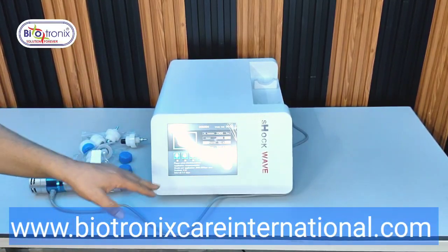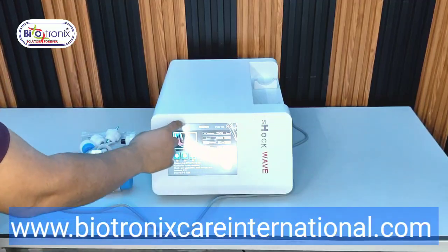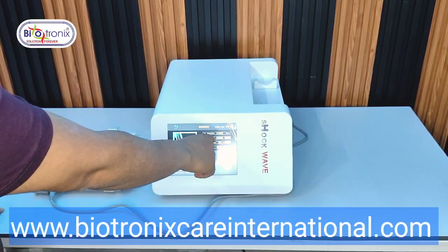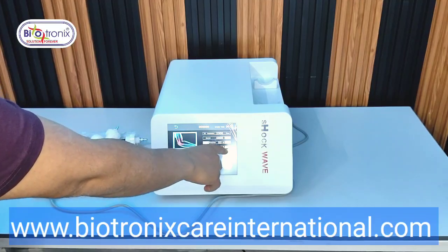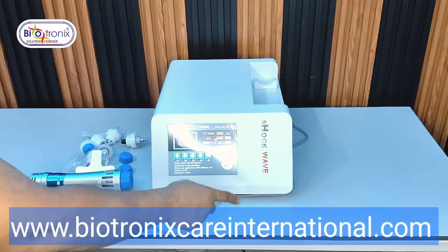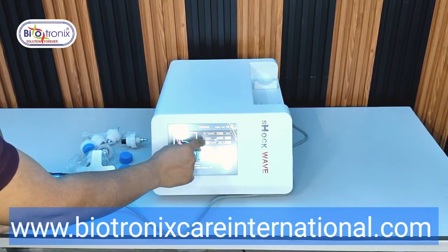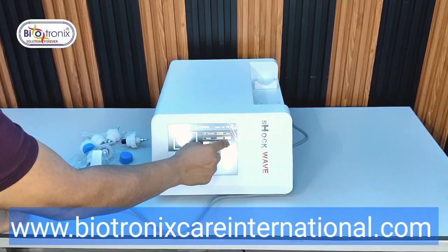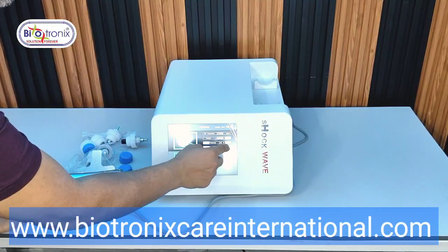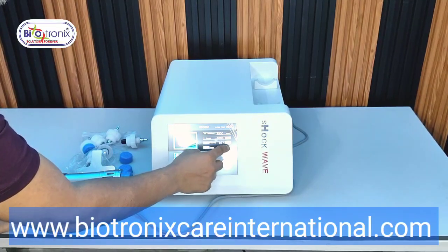For the elbow it is recommended, and you can see these recommendations are already over here. When you select the program, like I selected elbow, 2500 shots are there, frequency 3 Hz recommended, energy 20 millijoule recommended. You can increase or decrease the same according to your need, but these are the recommended ones. The frequency you can go from 1 to 16 Hz. Energy you can go from 5 millijoule, in multiples of 10, up to 200 millijoule.